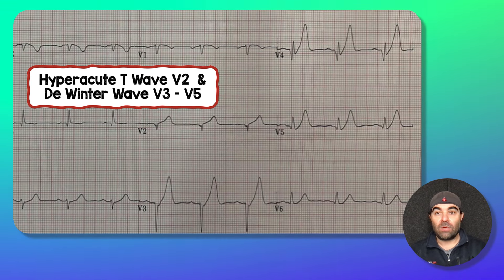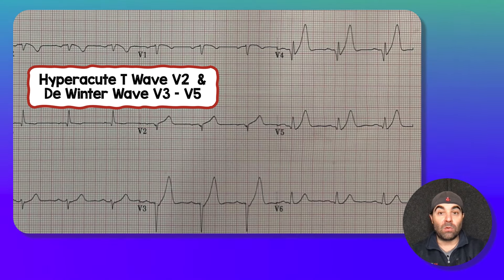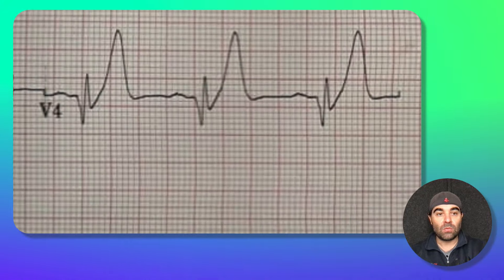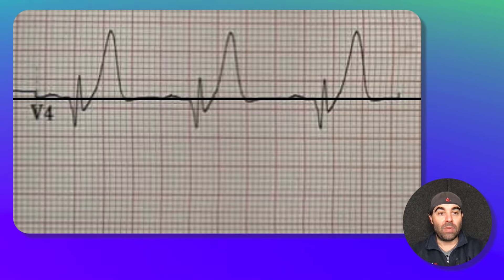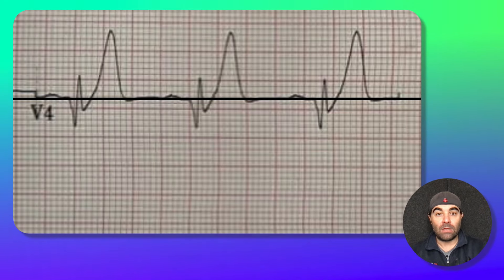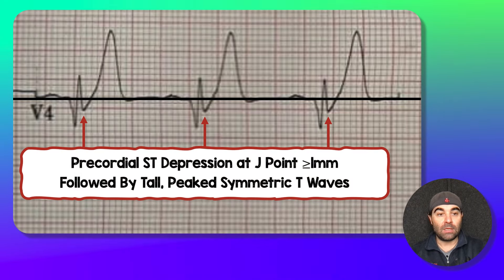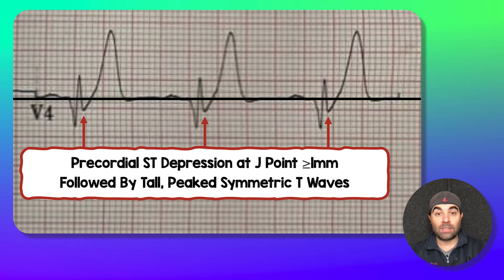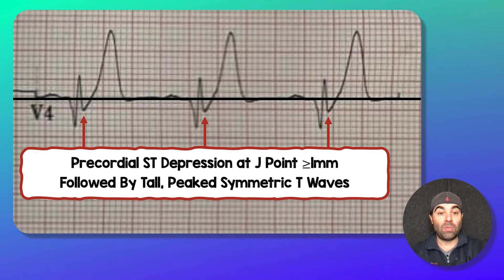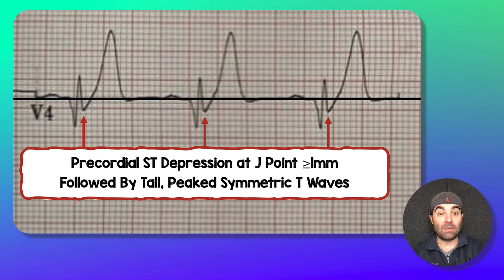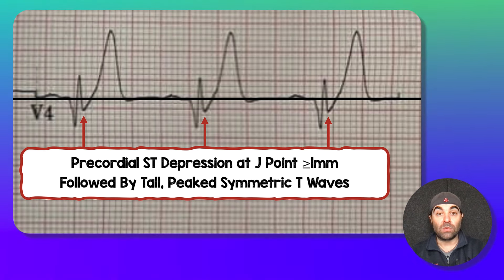V3, V4, and V5 have this finding called a DeWinter wave. Let's zoom in on V4. If we imagine that this black line represents our baseline, we need to look at these precordial ST depressions at the J-point — where your QRS meets your ST segment. You can see that's about two boxes below the baseline, followed by this tall, peaked symmetric T-wave. That is the classic definition and finding of a DeWinter wave.